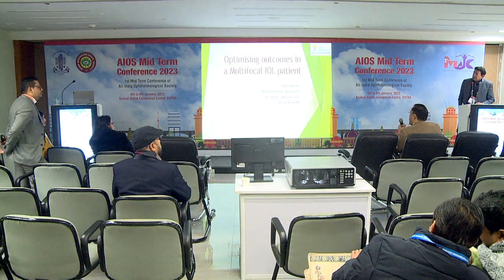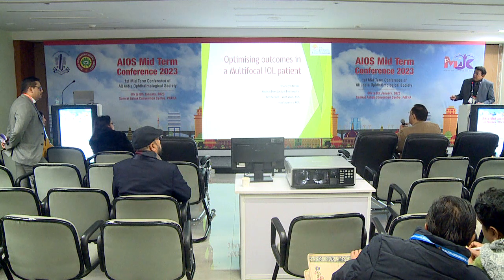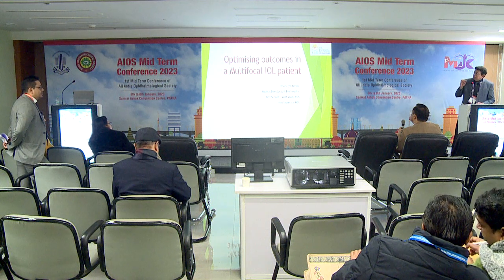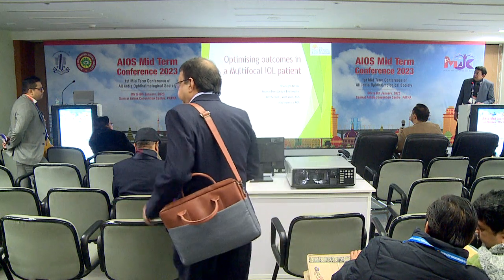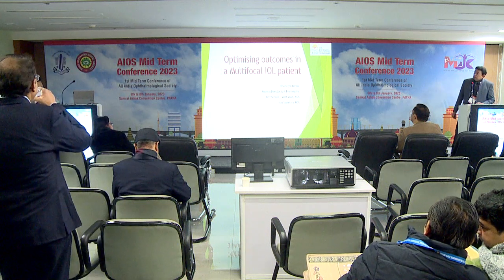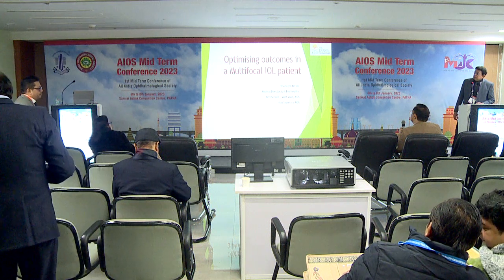It all depends on the extent of the trauma. So obviously, if the entire capsular bag has been torn, it's very extensive. If everything is fine, it's just a perforating injury, just a peripheral corneal scar is there. I have used toric lenses in these cases, and some of those cases come to you years later when the consequences of the early trauma are no longer there. Then definitely toric intraocular lenses can be used.